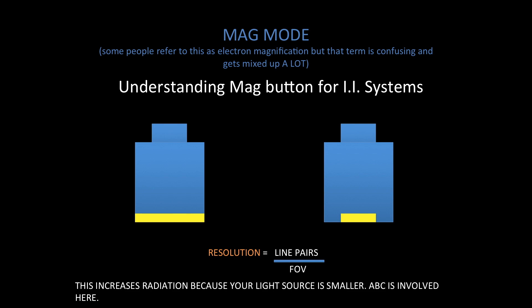The mag button — this mode is also called electron magnification. I think that term is confusing because it can be confused with electron gain, and also electron magnification can be confused with something else we use in flat panel systems. Therefore I think it's better to refer to it as magnification mode, and when they talk to you about magnification mode they need to tell you whether you're dealing with an image intensifying system or a flat panel detector system. Just know that magnification mode for I.I. systems is specific for this type of system and you shouldn't apply the concepts learned here elsewhere.